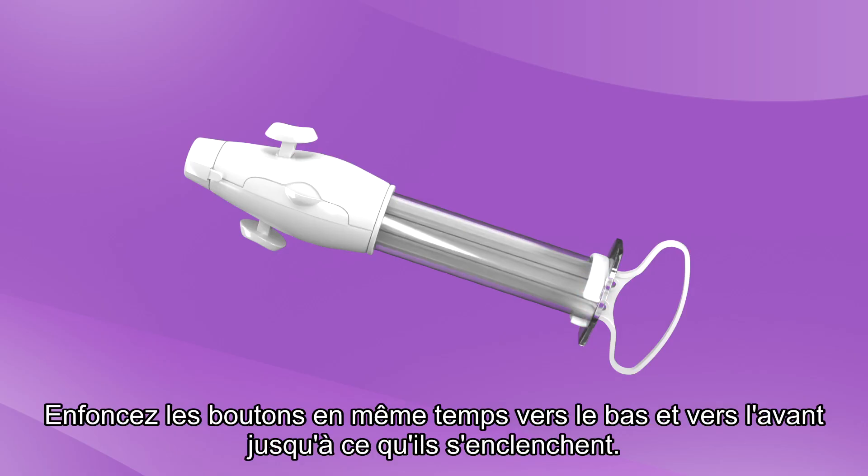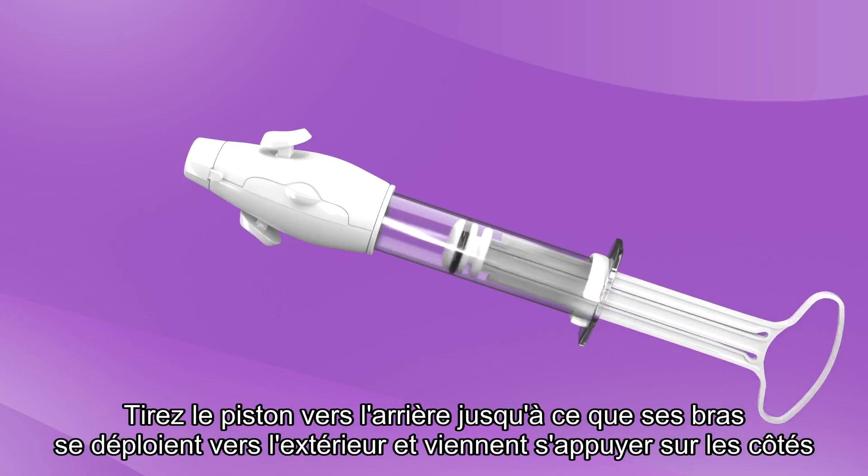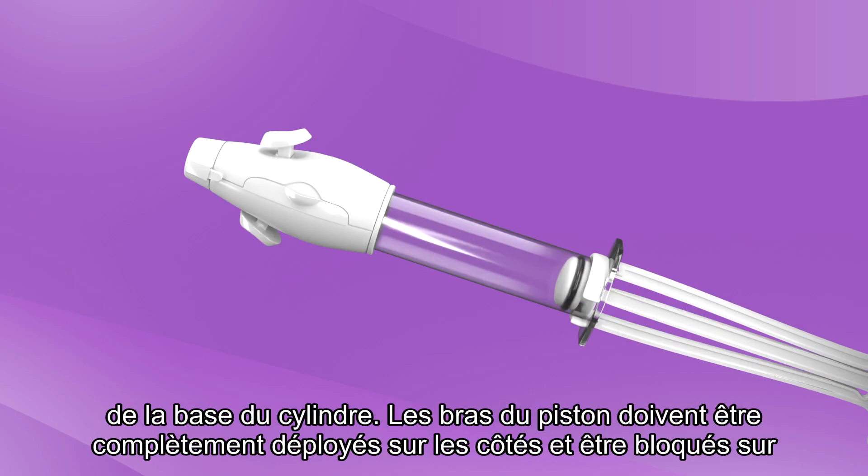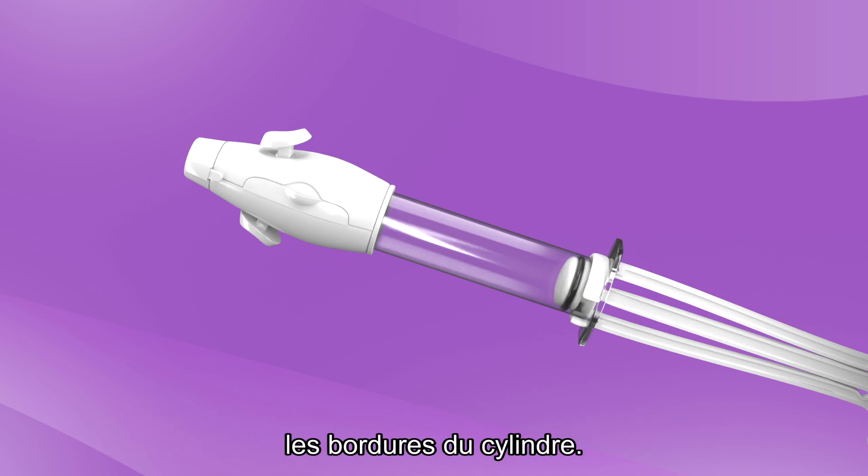Simultaneously, push buttons down and forward until you feel them locked. Pull the plunger back until the plunger arms snap out and catch on the wide sides of the cylinder base. The plunger arms should be fully extended to the sides and secured over the edges of the cylinder.